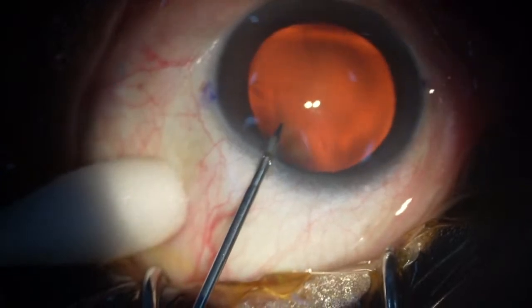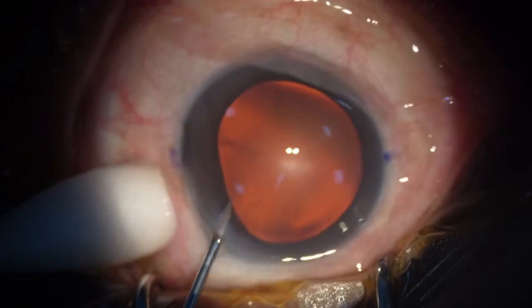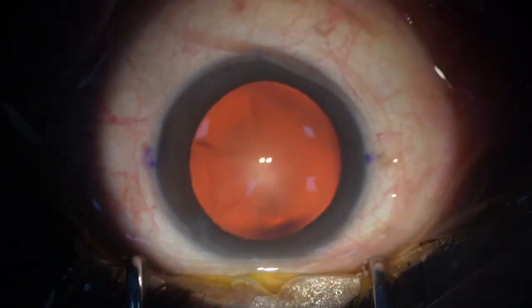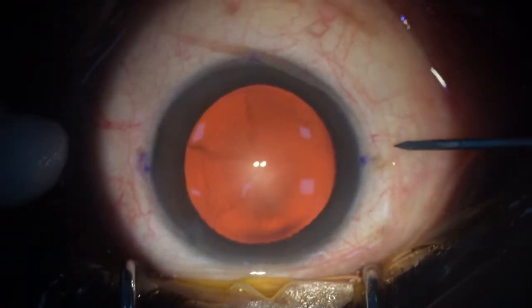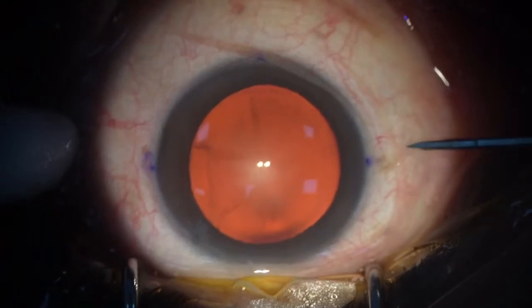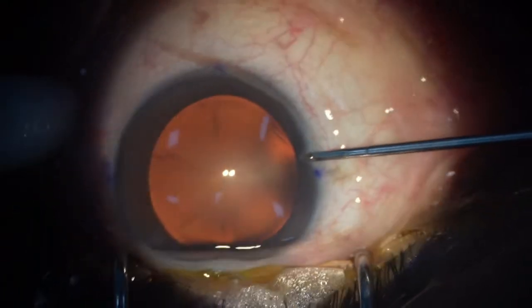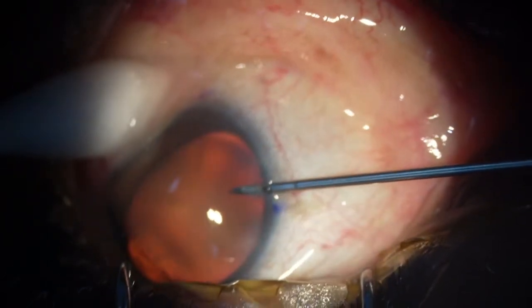23. Mostly because these patients are all under topical. Yeah, because they're all under topical, and you can see the reflex on the cornea from the vertex. So you have to center it on that. When the patient is looking into the light, it becomes easy, and then you can center it correctly.